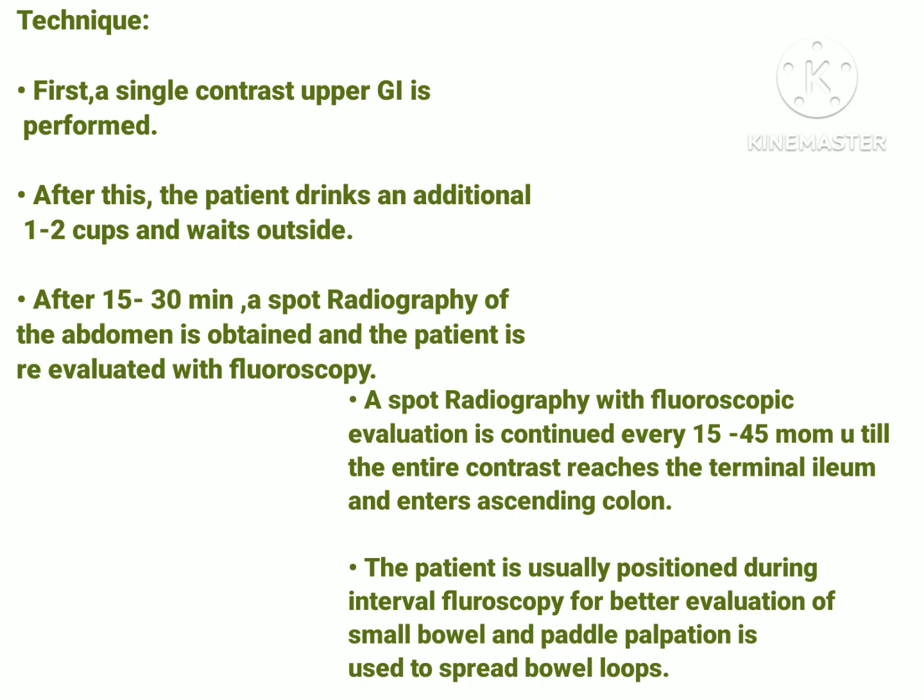After this, we give the patient additional drinks, 1 to 2 cups of contrast barium sulfate, and he needs to wait outside so that contrast flows from the stomach to the small intestines. It may take some time for the contrast to move from stomach into the small intestines, approximately 15 to 30 minutes. So after 15 to 30 minutes, we will take the spot radiography of the abdomen.